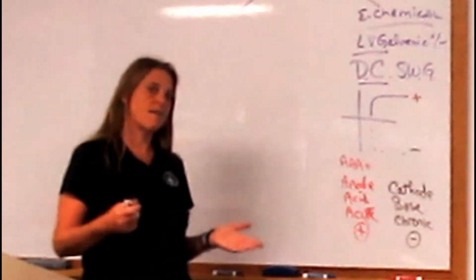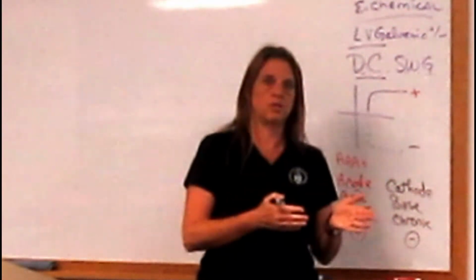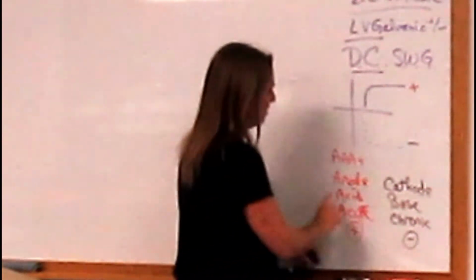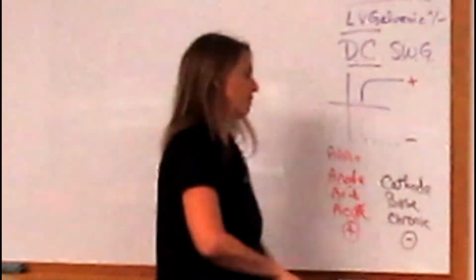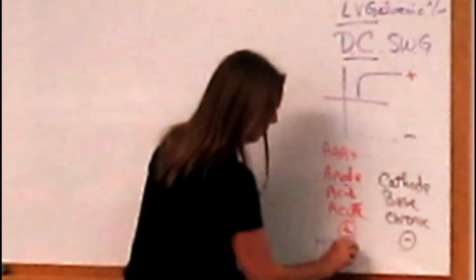Well, think about it. When you have an acute injury, you want to figure out, do I want to soften tissue or harden tissue? You want to soften tissue when you have a chronic problem. So the way I remember this is, what does the acid do to the tissue? Well, the acid does what ice would do to the tissue. For example, if you have acid, and we know that's for acute, it must harden the tissue.